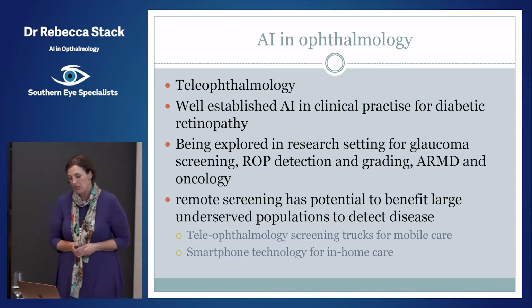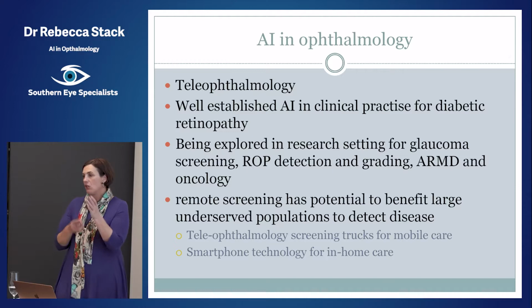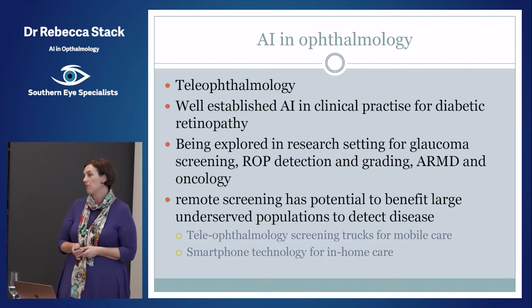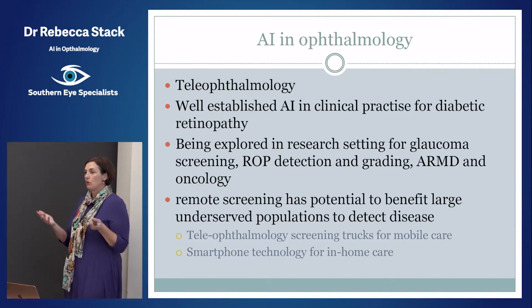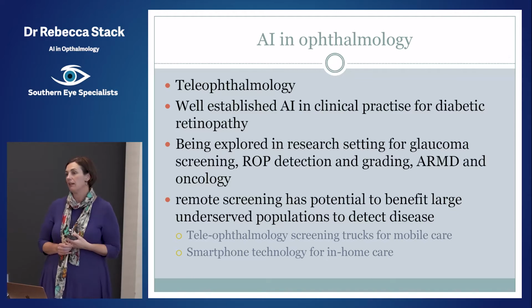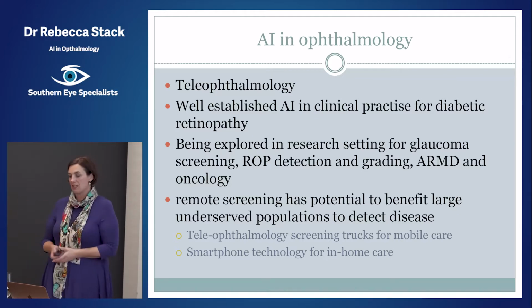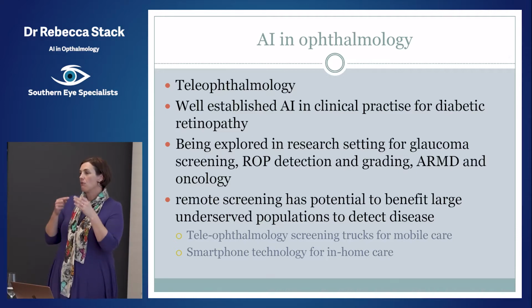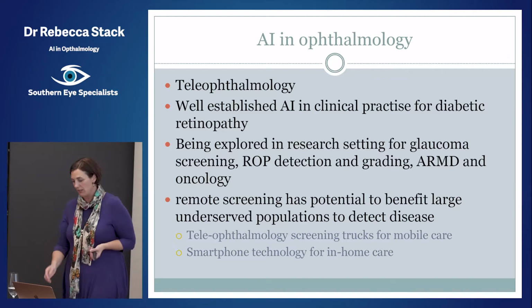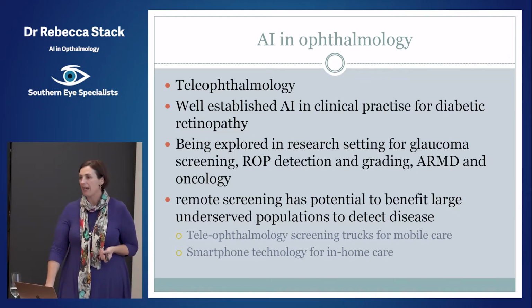At the moment, teleophthalmology could go around with big screening trucks, take images of people, and then you could transfer those images somewhere else for someone to analyse them and make a decision. That was really where it all started from, because that's what was going on. It's what we do here locally. You see the patients, you take images, you grade them, you send them in for an ophthalmologist to take another look at. It's not very much of a step for all of those images that are already being stored electronically to be analysed by a computer instead of a person, and for it to spit out an answer.